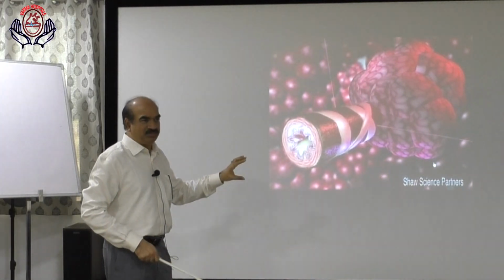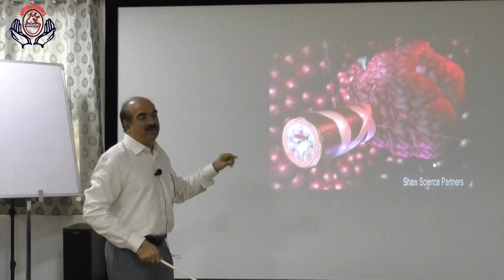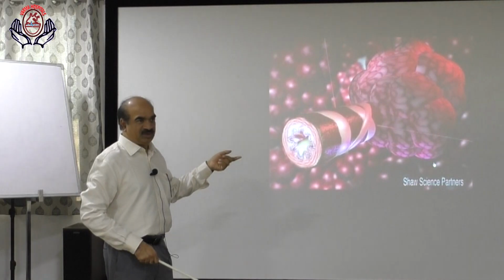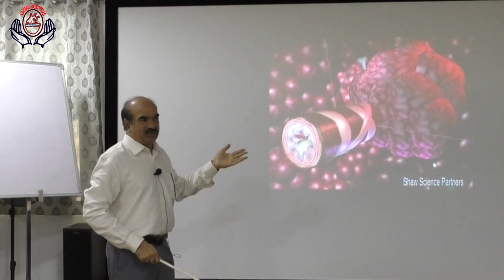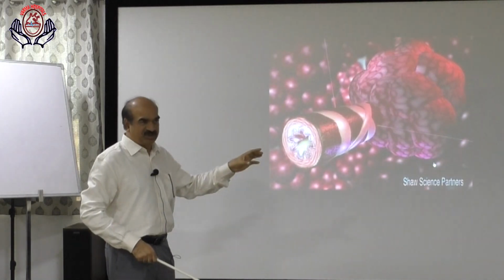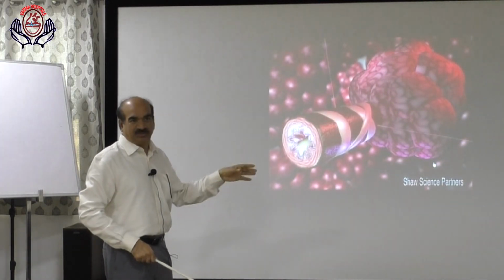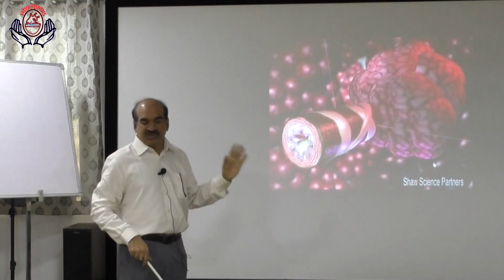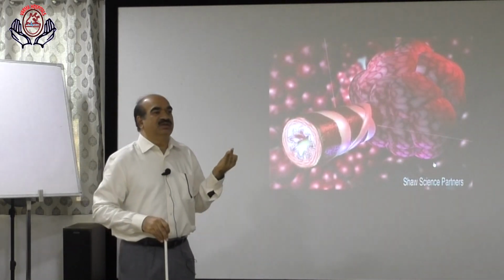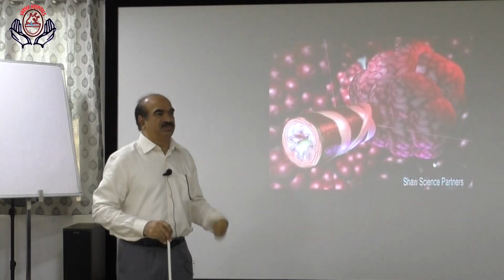How will PEEP be provided? We will set PEEP. How do we improve oxygenation? By increasing FiO2 or by increasing mean airway pressure. So in pure oxygenation failure, we will focus on PEEP and then FiO2 and mean airway pressure.